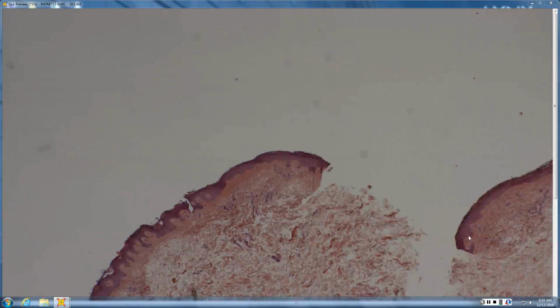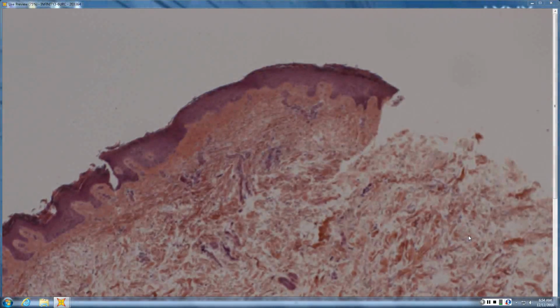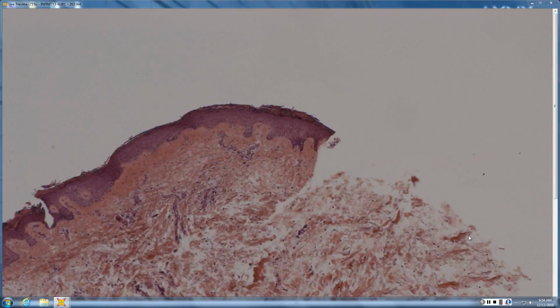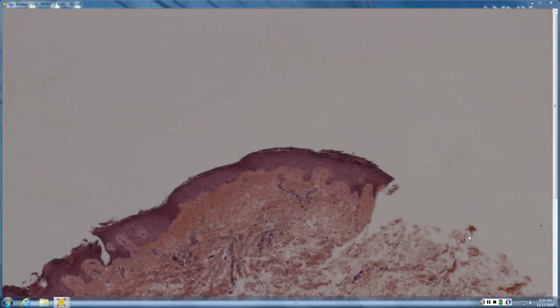Okay. What do you notice here? Sorry, I'm going to get this back in focus for everybody at home. Pink material in the papillary dermis. So I think that's fairly normal papillary dermis, actually. Maybe more wispy collagen bundles.